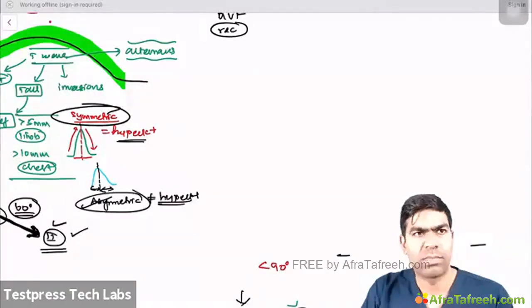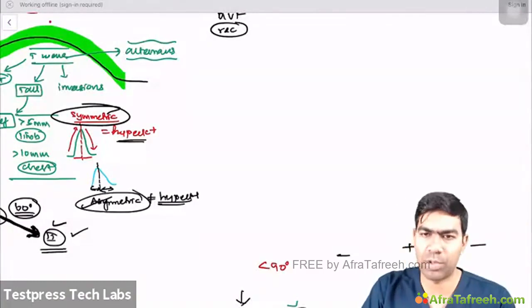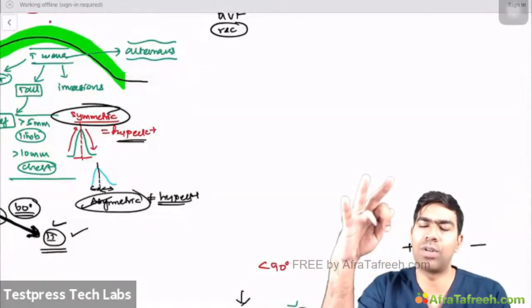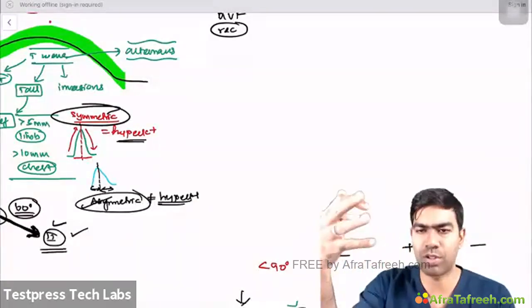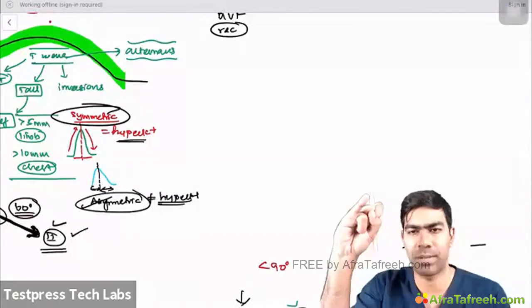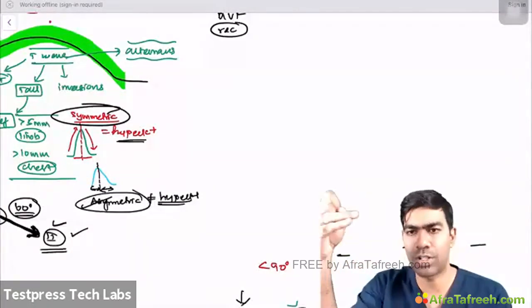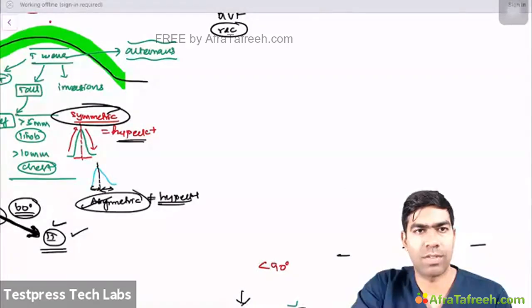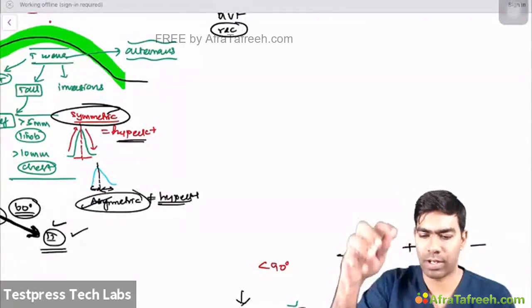Then, simple LVH, left ventricular hypertrophy. Sometimes LVH itself can produce tall T waves. So that point is also important. So 3 things you have to note as far as exams are concerned that can produce tall T waves. First is hyperkalemia. Second is the hyperacute stage of STEMI. And third is left ventricular hypertrophy. Left ventricular hypertrophy itself can produce taller T waves without a doubt.